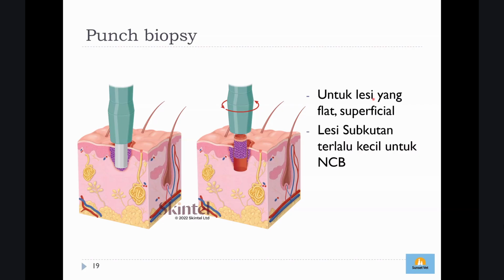because you will literally clip the hair, and then you want to see, okay, this is the lesion that I want to take. It's literally like you punch with something, press it and then you take it. So you put it on the position of the mass and then you press it, you're gonna get something because typically the blade is circular.